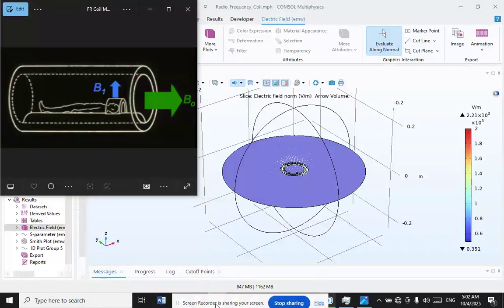And what are the types? RF coils for MRI can be grouped into two different classes, volume coils and surface coils. Volume coils are designed to provide a homogeneous RF excitation across a large volume. Most clinical MRI scanners include a built-in volume coil to perform whole-body imaging, and smaller volume coils have been constructed for the head and other extremities. Common designs for volume coils include birdcage coils, TEM coils, saddle coils, and two-dimensional cylindrical high-pass ladder.